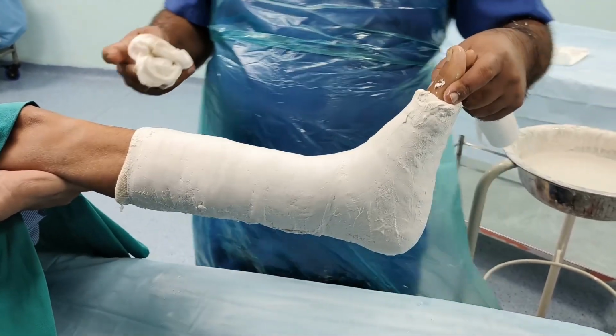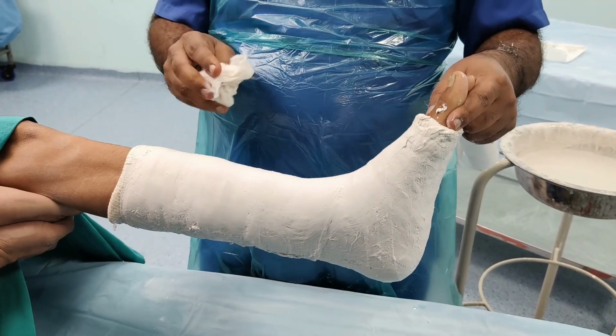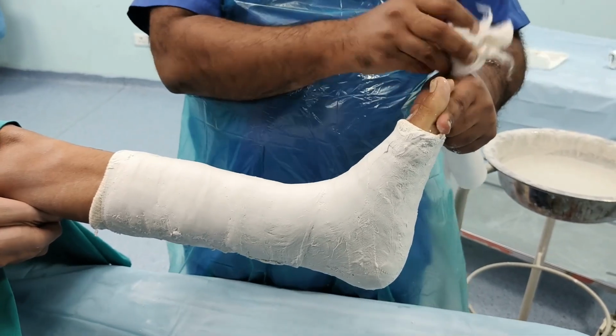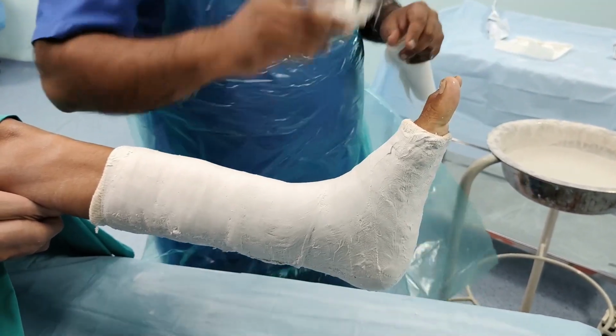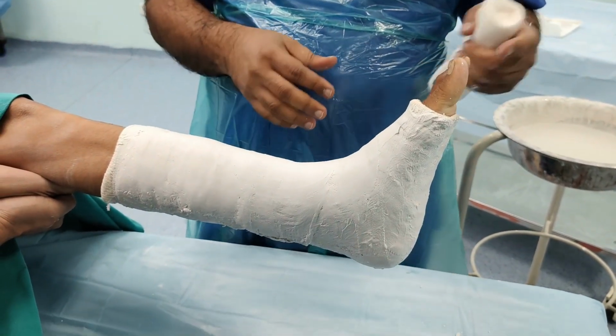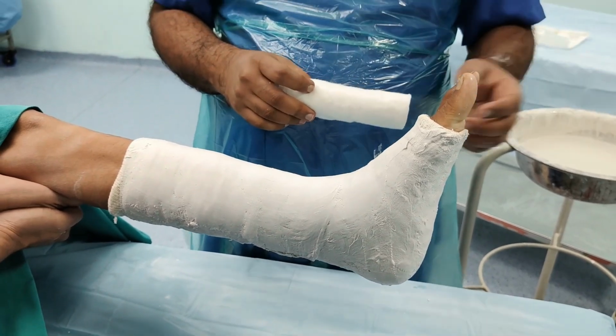The take home message whenever you are applying a plaster is that you have to tell certain important precautions to the patient, which are always essential. That the limb has to be kept elevated on a pillow or two pillows.